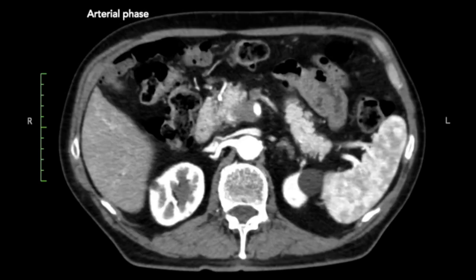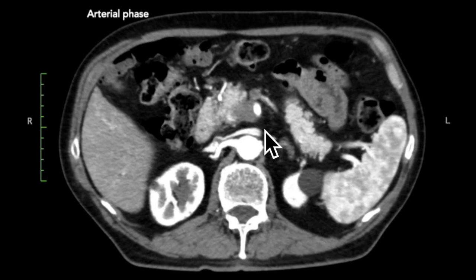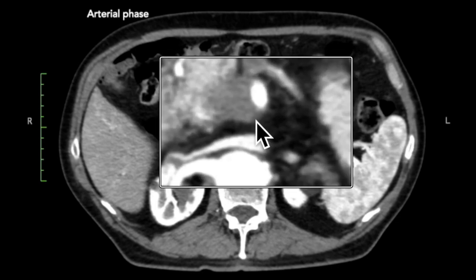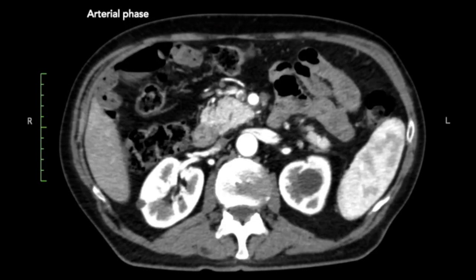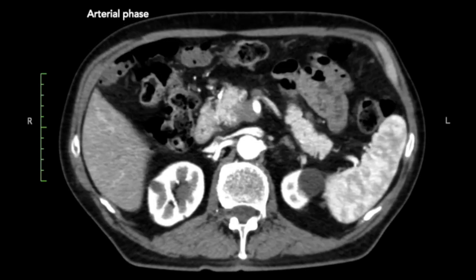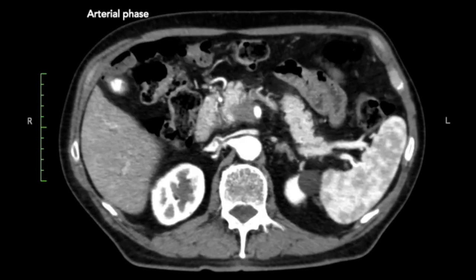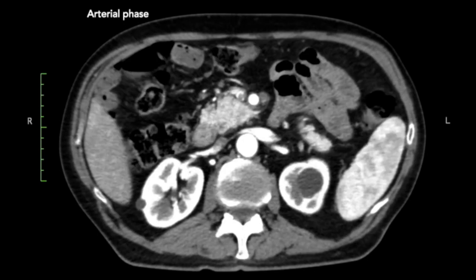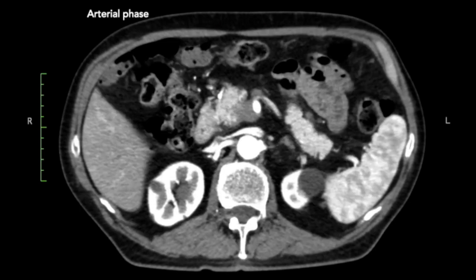Then looking at tumor extension — the lesion is on the medial side of the pancreatic head and shows clear extension on the medial side in the fat towards the SMA, with clear involvement of the SMA going upwards, about 90 to 180 degrees — just less than 180 degrees involvement of the SMA — with some slight narrowing. There is a larger caliber downstream, no irregularity of the wall. This type of tumor extension is consistent with tumor growing through the SMA plexus towards the SMA, a typical kind of extension.